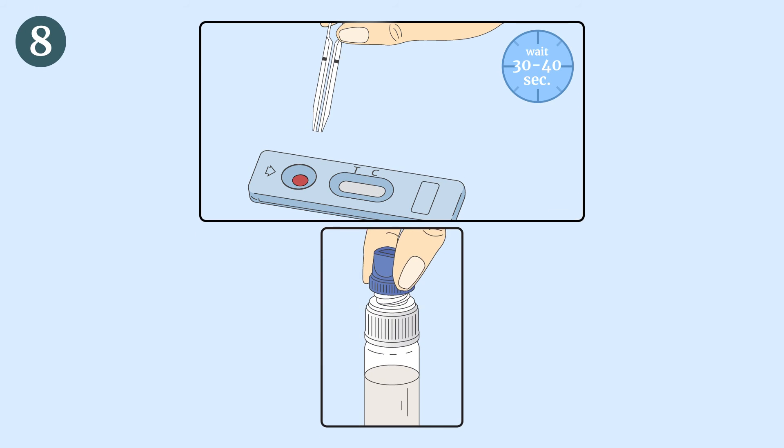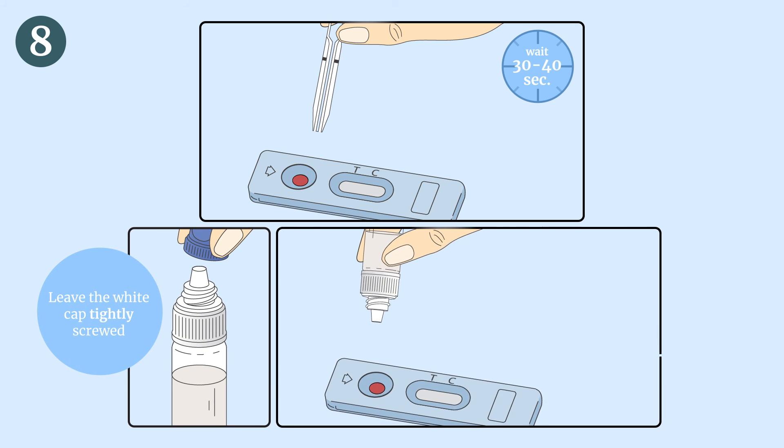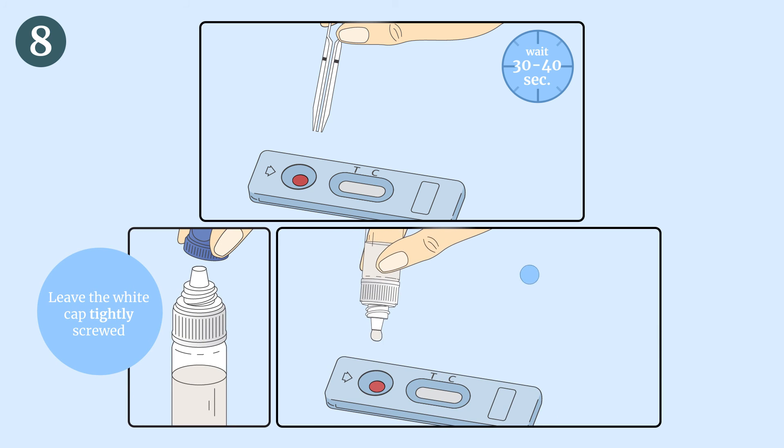Unscrew the blue cap of the diluent dropper bottle, and by holding the dropper bottle vertically, slowly add exactly 4 drops in the sample well of the device with an interval of 2 to 3 seconds between each drop.